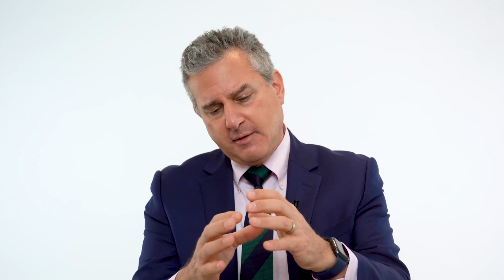The final improvement, which has been very helpful for certain patients, has been that they've designed it with a larger optical zone. It doesn't go all the way to the full range because the thickness would be too much. But for the vast majority of high myopic eyes, we're able now to use a much larger optical zone than before, and this means that the probability that the pupil in the dark will go beyond the edge of the lens is much, much lower. And so the incidence of glare and night vision disturbances has gone way, way down.